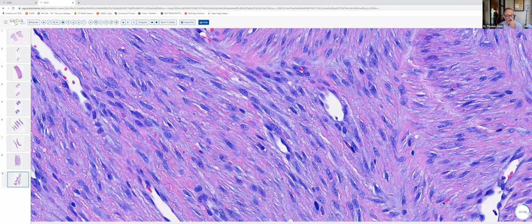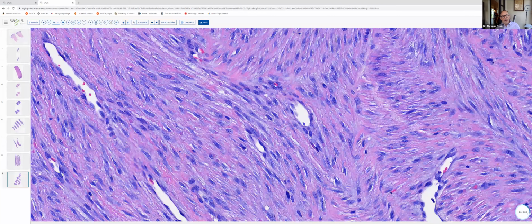These will stain positively with PTAH, phosphotungstic acid hematoxylin stain. They stain purple. And with immunohistochemistry, these will stain with SMA or desmin. And so these cells are myofibroblasts, and the inclusions are intermediate actin filaments that are present within the cytoplasm, very characteristic of an infantile digital fibroma.